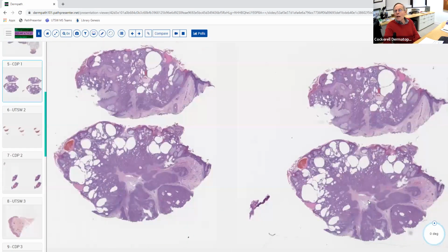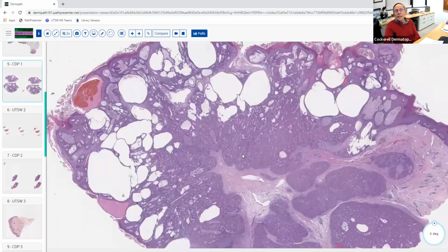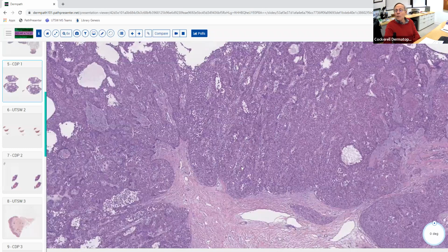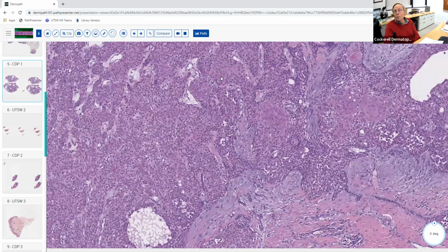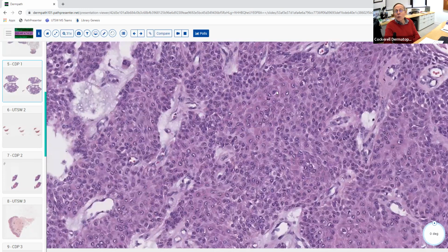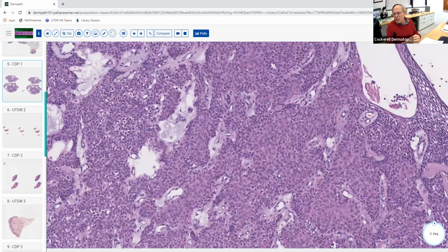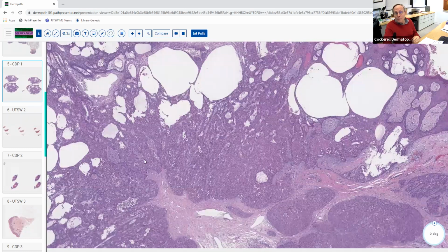So just in contrast, this is another adnexal neoplasm. And notice that this one doesn't have really much mucin in it. If there's any mucin here, it's just in the fibromucinous stroma that's surrounding the epithelial aggregations. And it's got some clear staining cells here also, and some basophilic cells as well. But it doesn't have a lot of ductal differentiation. It's got some over here, but it doesn't have the same number that we saw in the mixed tumor. It doesn't have the mucin, doesn't have the chondroid differentiation. So this is an example of a nodular hidradenoma.